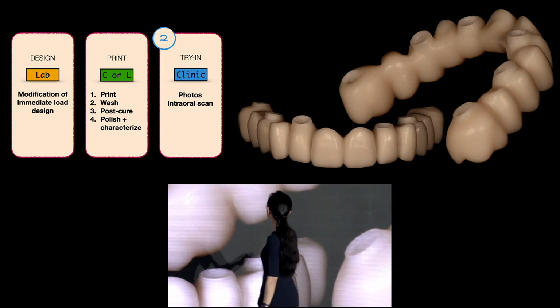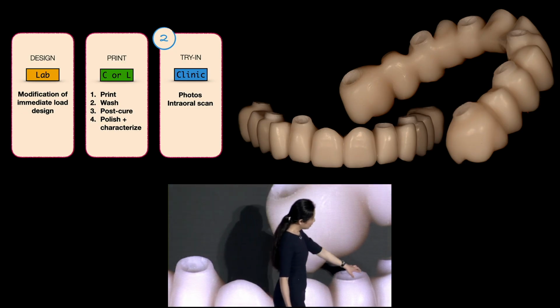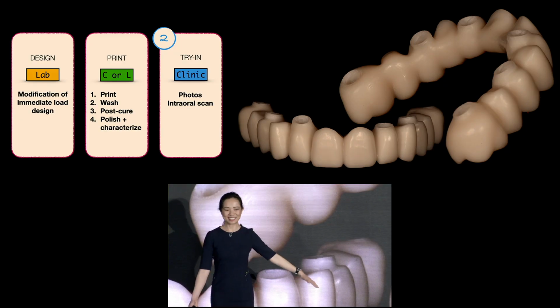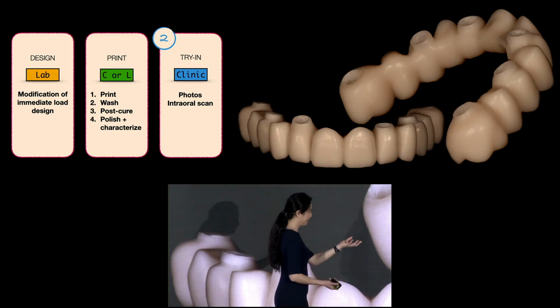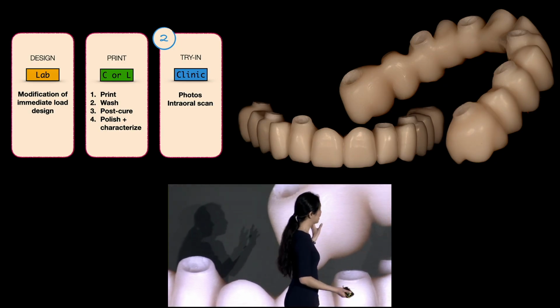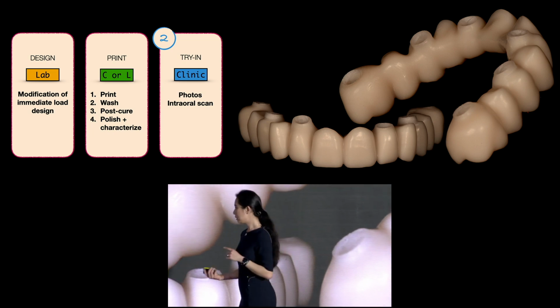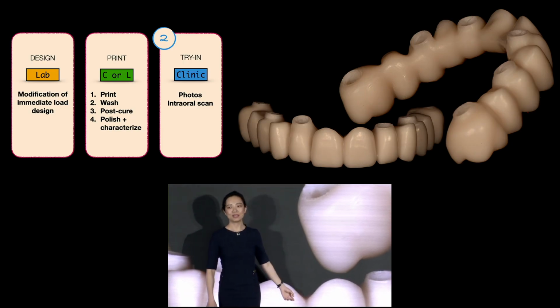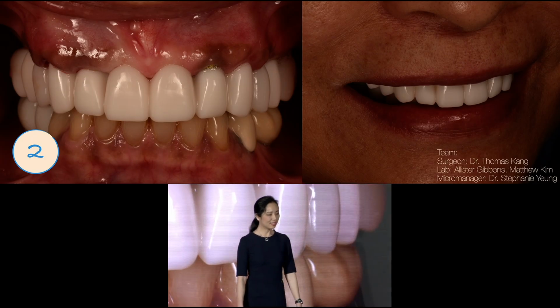So what you'll see here is that we've designed everything as closely as possible to what we would want in zirconia. And you can also see here, I have the ability to go, okay, lab, what is with this? Fill it in, giving you a nice gooseneck there. It gives me the ability to evaluate the design in my hand and also see how it looks on the patient. But you can see also how nicely everything prints out now. This also gives me the ability to see the patient's tolerance of a monolithic restoration, because when you print anything, it's all one resin.